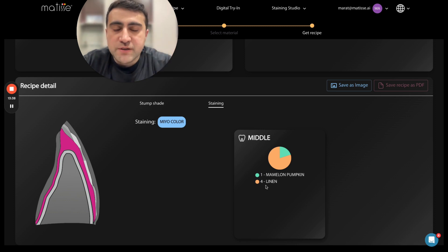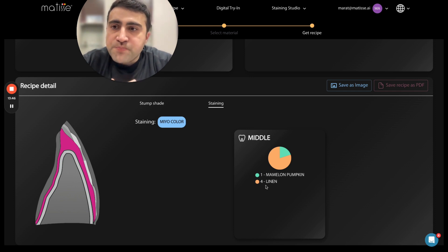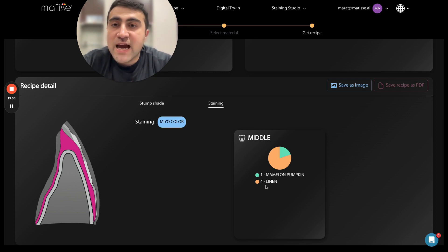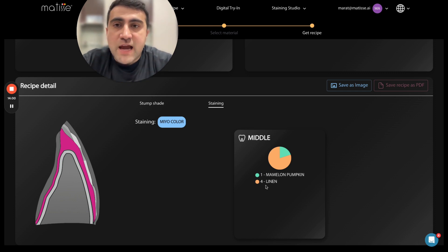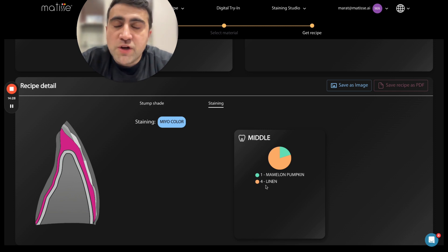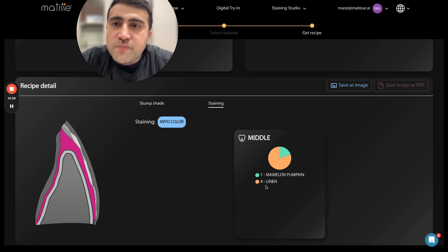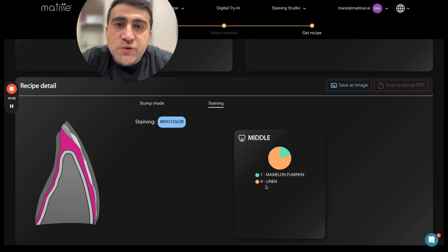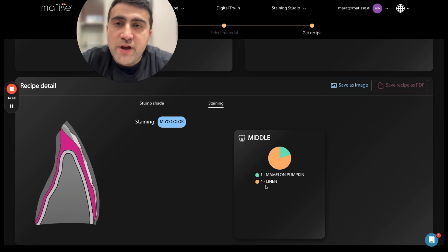Some tips: Shade Guide AI can be used three ways. First, use your interpretation to find the shade guide and take a photo with a digital camera using dental photography settings: shutter speed 1/125, aperture F22, ISO 100–200, shoot JPEG photos. Control your flashlight — with Shade Guide AI you can use ETL, that's fine.